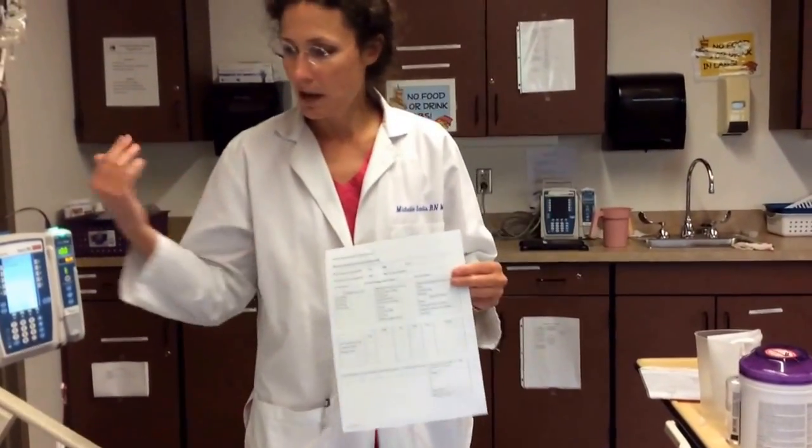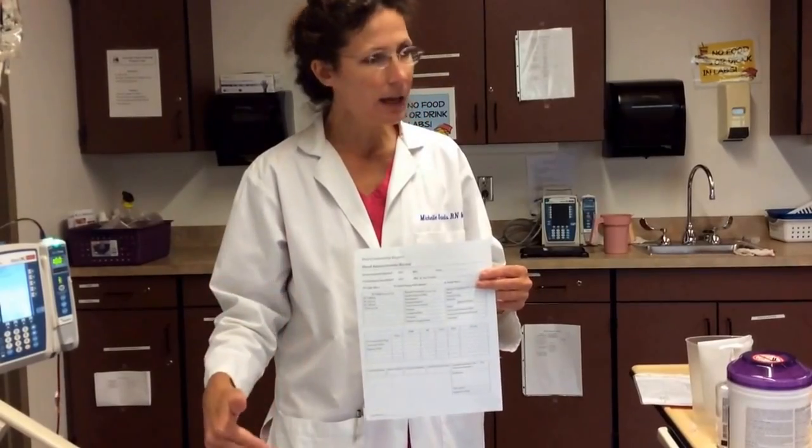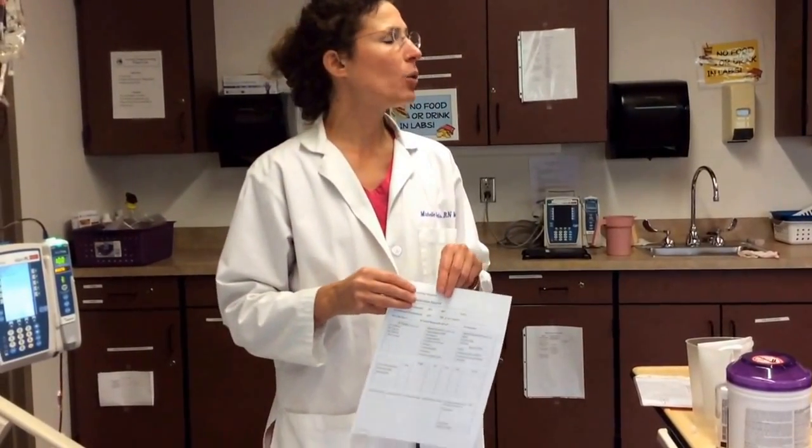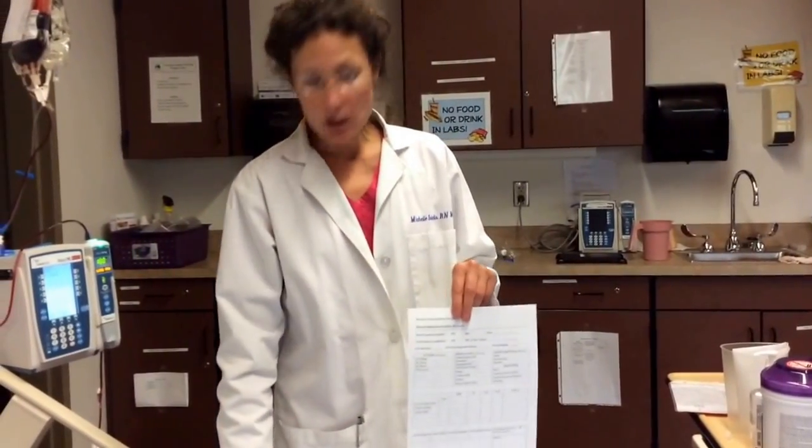I'll complete my documentation on the blood administration flow record, including what I've hung the blood with, what gauge of needle or IV catheter he has. Mr. Smith has a 20 gauge, and for an adult, we like to see a 20 gauge needle or larger, so 20, 18.